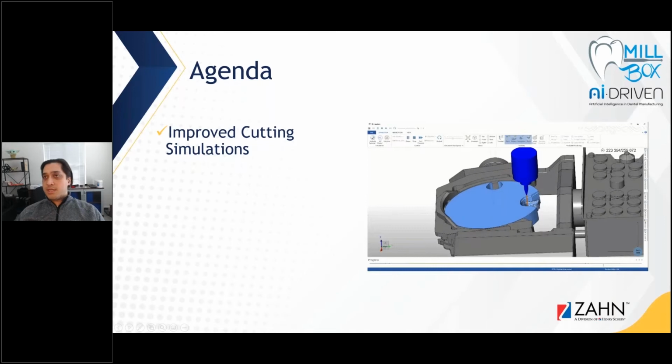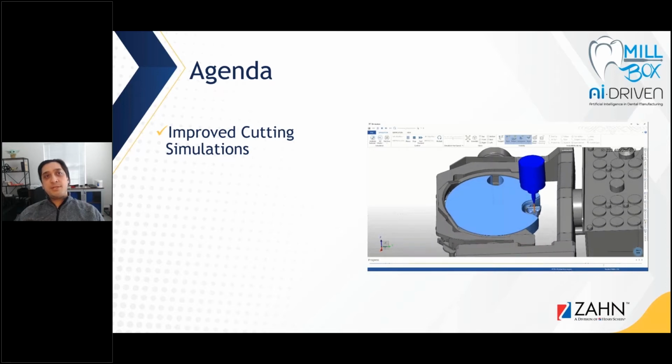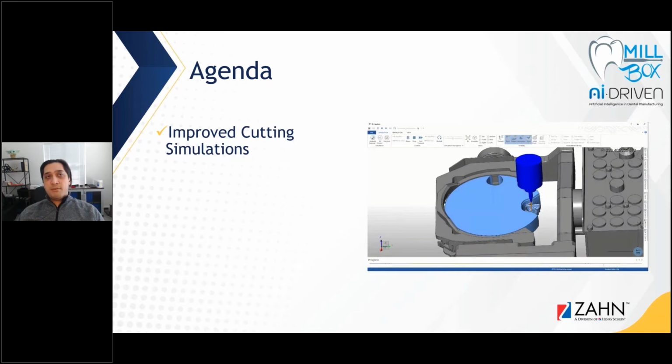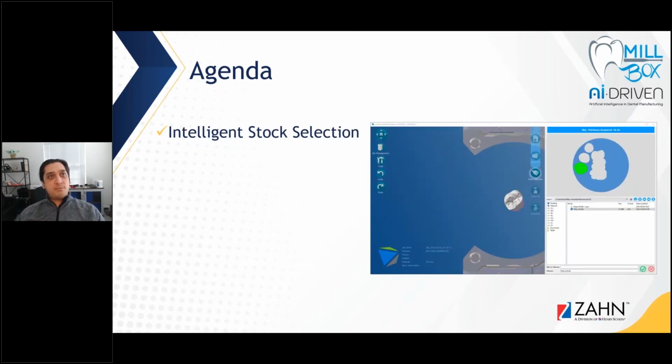Just to show you a general agenda about what we're going to be discussing today, we're going to be talking about the improved cutting simulations, spending a little bit of time talking about the simulation tool and how we can best leverage it to its fullest, to improve your productivity and also for troubleshooting should you have any problems that arise during the milling process.